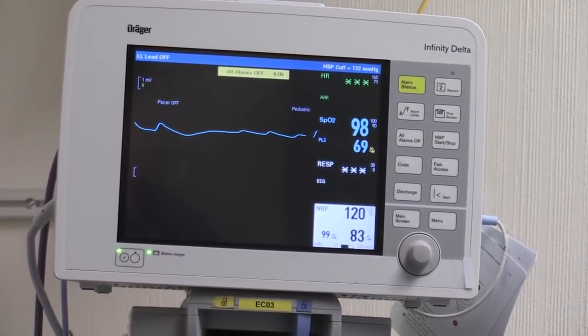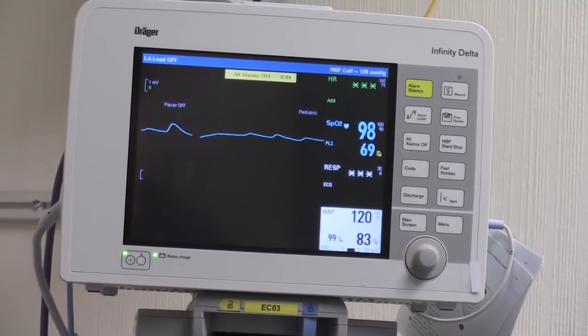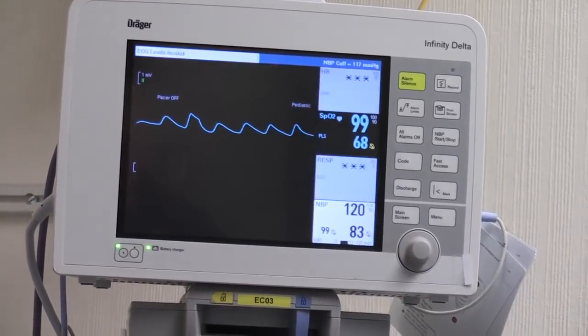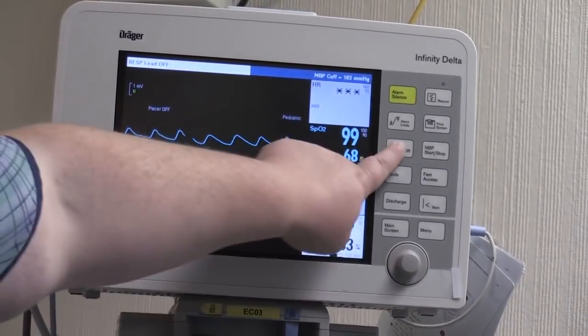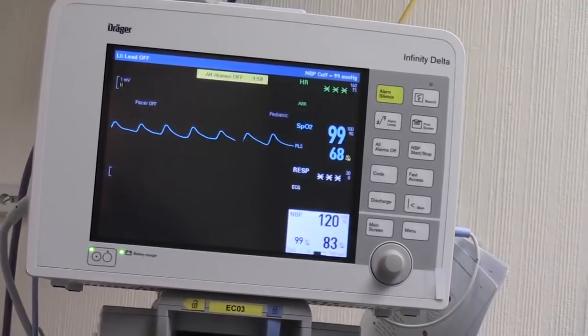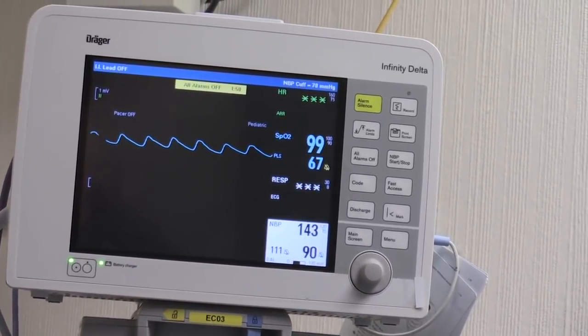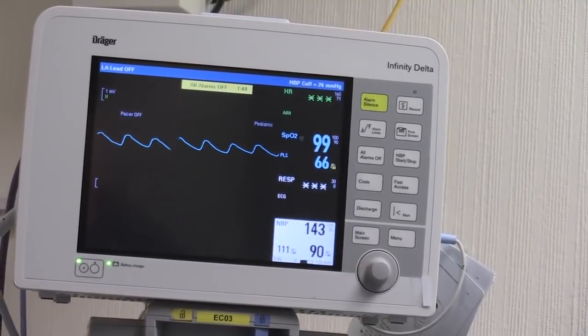Yep, there goes your waveform immediately. So I think this is important to document that, you know, you're in a trauma situation, you have a pulse oximetry attached to a finger, and all of a sudden you lose your waveform. Think about the fact you have that blood pressure cuff going up and down.